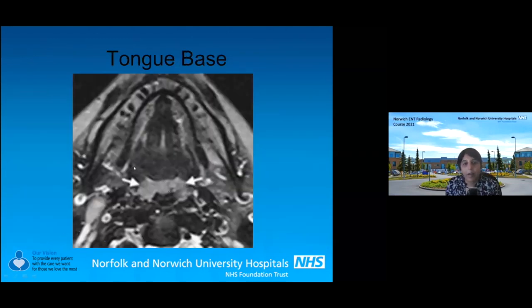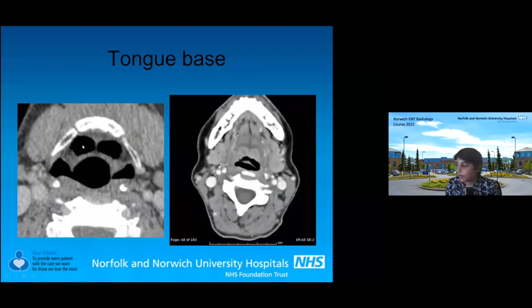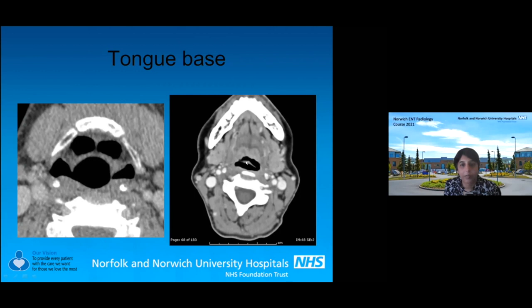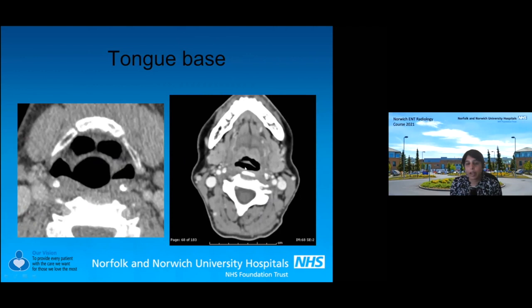The tongue base covers the posterior third of the tongue; the anterior two-thirds is the oral tongue and therefore maxfax territory. The posterior third includes the lingual tonsils and the valleculae. You can also see the epiglottis when looking at the base of tongue — the glossoepiglottic fold and pharyngoepiglottic folds — but these are actually laryngeal structures. The epiglottis is called the imposter because it appears at the level of the oropharynx but is actually a laryngeal structure.